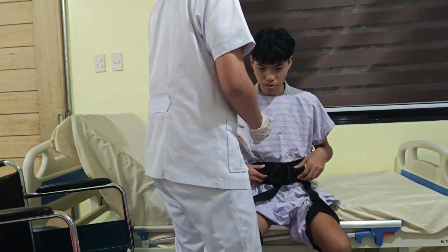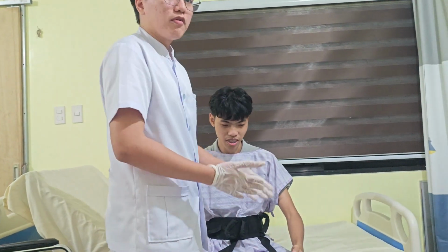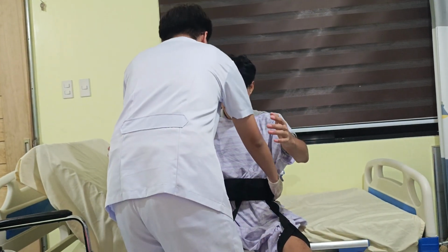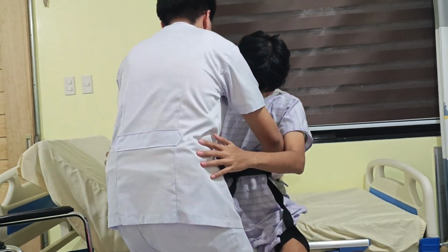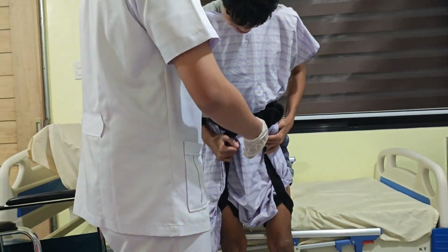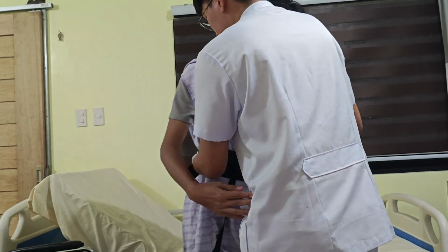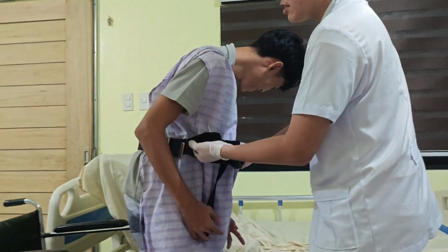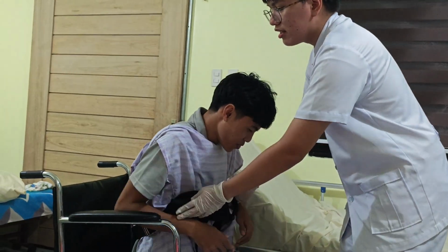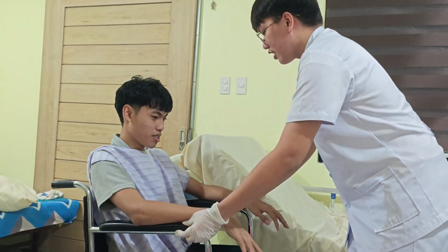Next, I'm going to ask the patient to stand up while I'm assisting the patient. Sir, could you please stand up on the count of three? So, 1, 2, 3. Okay. Next, I'm going to assist the patient until the patient is able to feel the edge of the wheelchair. Once the patient is able to feel the edge of the wheelchair, I'm going to ask the patient to sit down and move their hands onto the armrests.